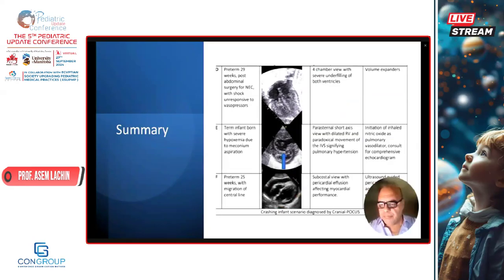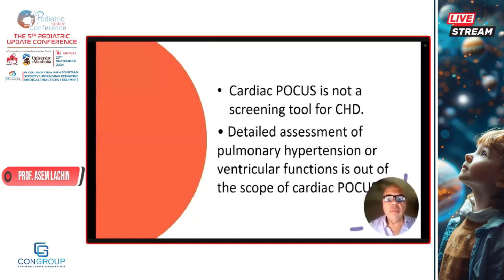So this is the cardiac module, and as we mentioned, the cardiac POCUS is not a screening tool for congenital heart disease, nor is it a detailed assessment of pulmonary hypertension or ventricular function. Totally, this is out of the scope of this cardiac assessment.